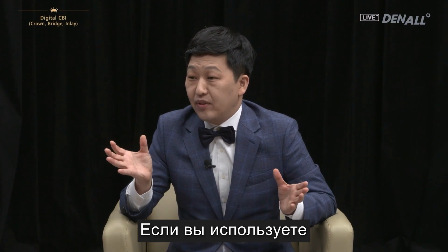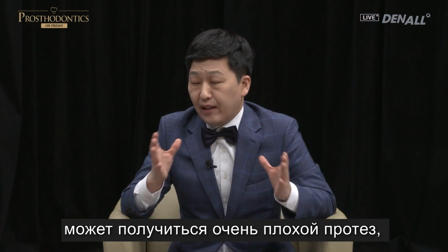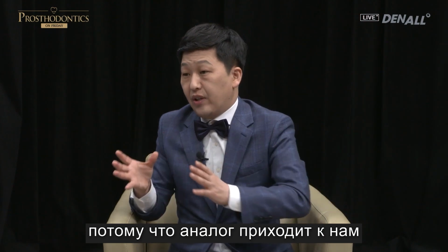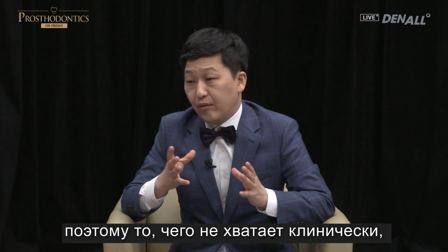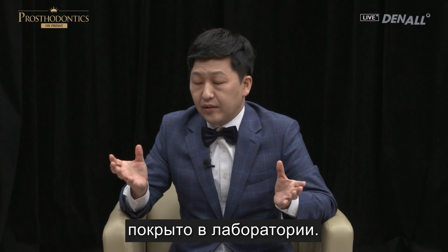If you do digital in a half-minded way, really bad prosthesis can come out because analog, it comes to us after being processed by a lab technician, so what is lacking clinically can be covered significantly at the lab.